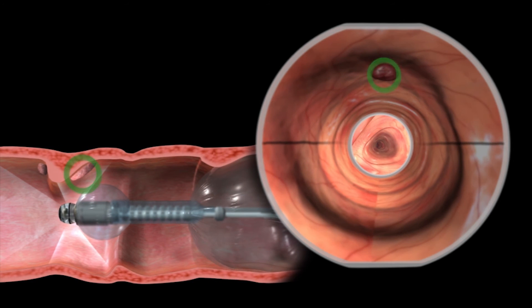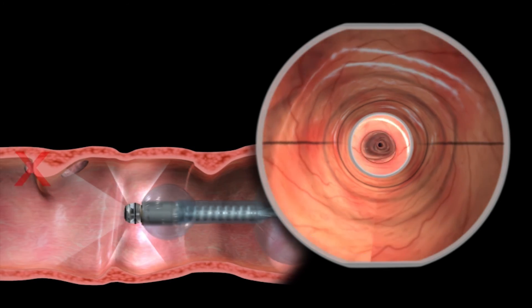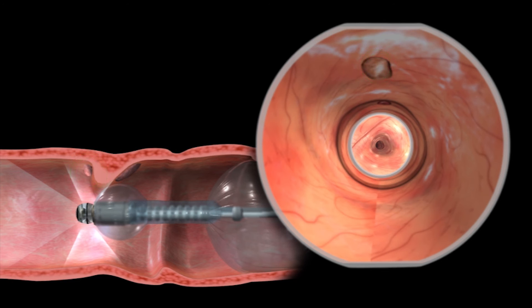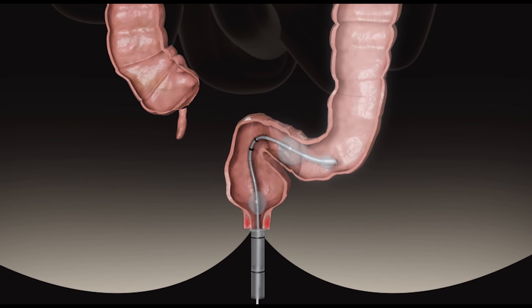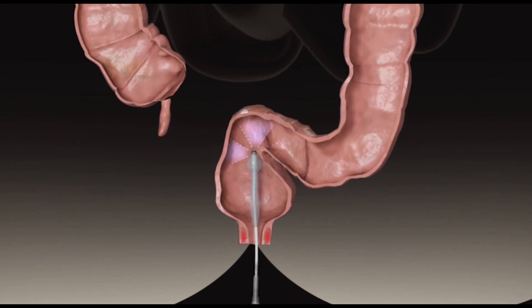While scanning the colon, polyps are visualized in the OmniView and then the front view. Some polyps seen behind folds in the OmniView may not be visible in the front view. As the scanner approaches the rectum, the rectal balloon is deflated. Using the OmniView, the rectum is fully visualized without the need to retroflex.